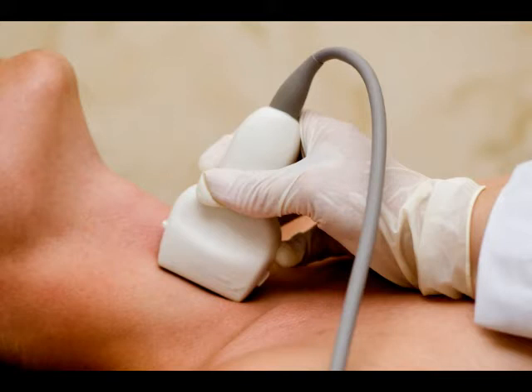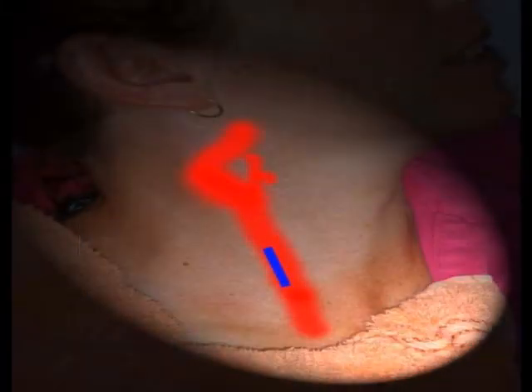Several transducer positions can be used to examine the carotid arteries depending on the location and the course of the vessel. This picture shows some common probe positions including anterior, lateral, posterolateral, far posterolateral, and transverse positions.